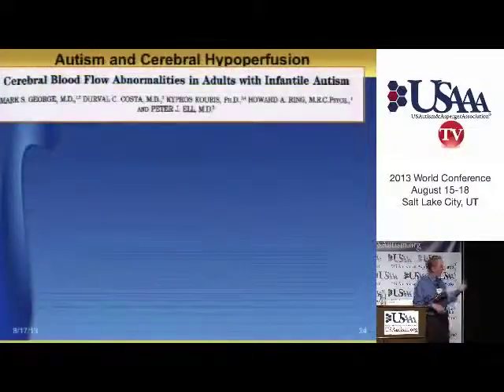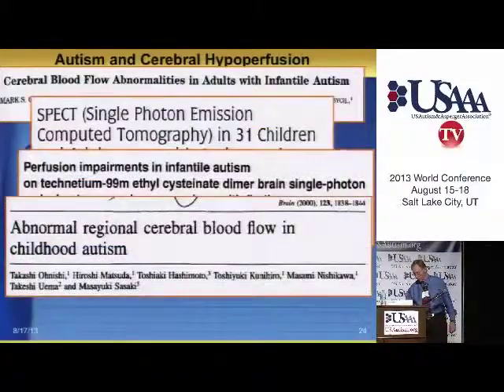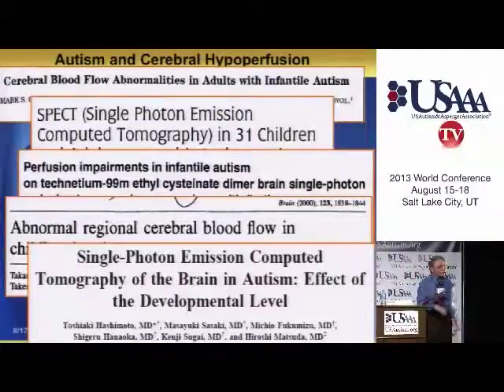Now, 15, 20 years ago, I see this is one of these progressive slides. But the simple point is that brain SPECT imaging's been around for 30 years or something, and when we were doing this imaging 10, 15 years ago, the concept at that time was that something that's not working properly should be an area of decreased function in the brain. And so that's all we did, we looked at areas that were decreased, and we saw areas that seemed to be like increased function, but we didn't know what to do with that at that time, so we kind of ignored that.